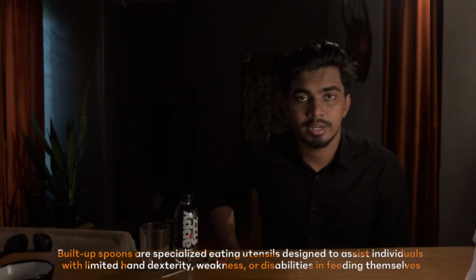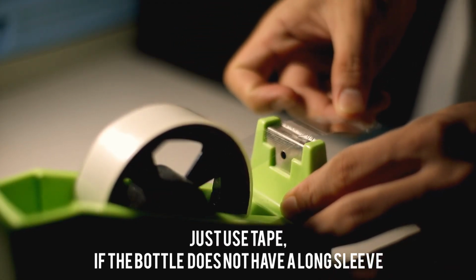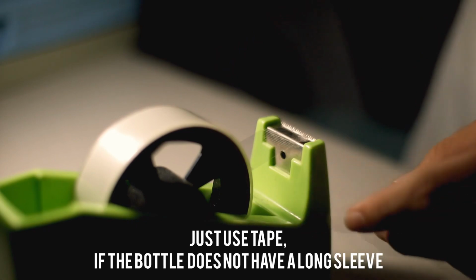To make one of these at our own homes, you can find one of these 250 ml small bottles lying around in your home, and you can take a regular spoon. What you can do is just insert the handle of this regular spoon into the sleeve of the bottle. So you can see this looks something like a built-up spoon with a large and cylindrical handle. You can use this like how you use a built-up spoon. You can easily hold this and manipulate it. It is much easier to eat using this setup.